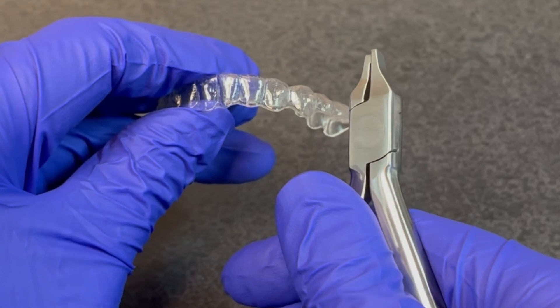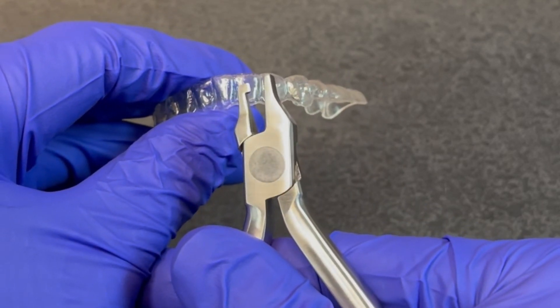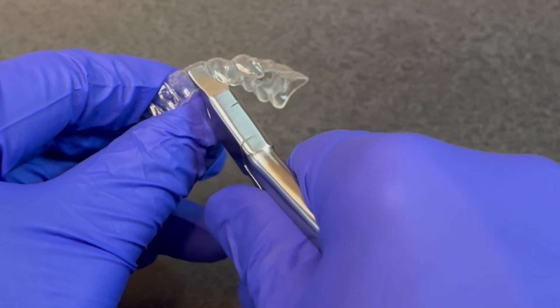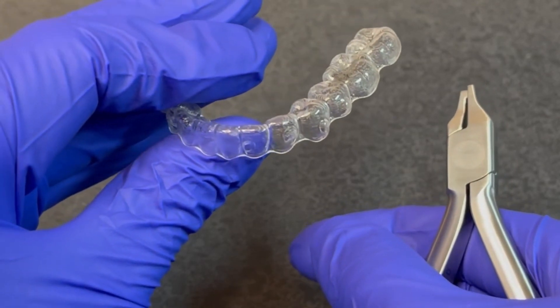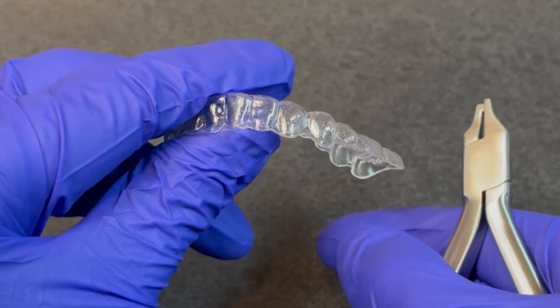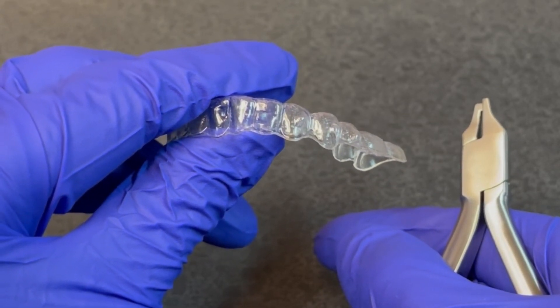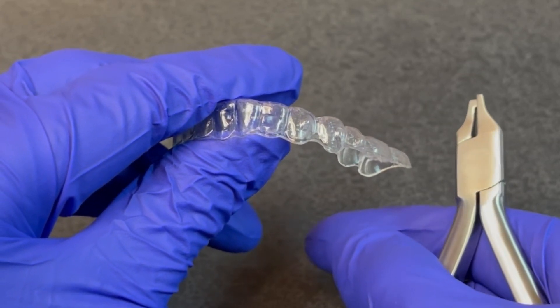An alternative method is to create an attachment to place on a tooth. By positioning the plunger portion of the wedge instrument inside an aligner and squeezing, an outie reservoir is created. This can be filled with composite and cured to create a wedge attachment bonded onto the tooth to enhance tooth movement for a subsequent set of aligners.